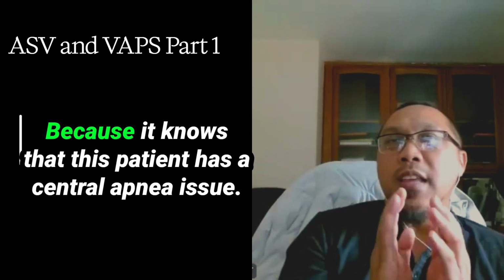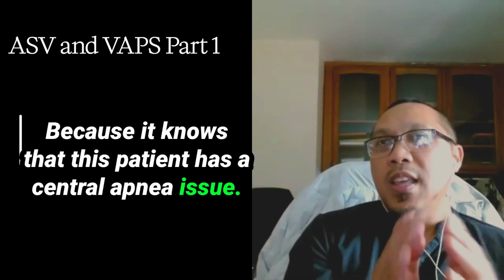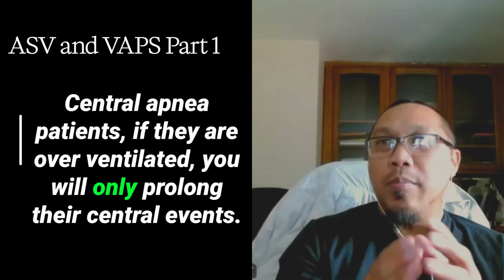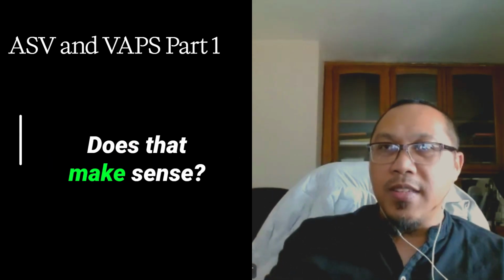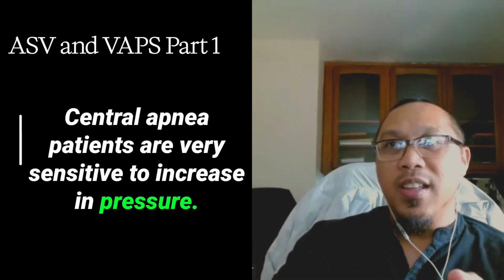Why? Because it knows that this patient has a central apnea issue. Central apnea patients, if they are overventilated, you will only prolong their central events. Does that make sense? Central apnea patients are very sensitive to increased pressure.